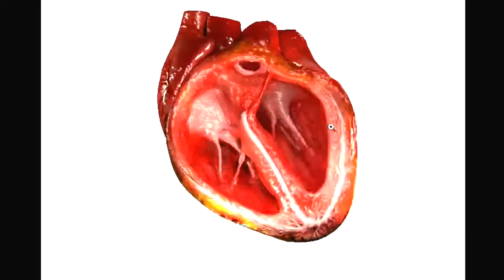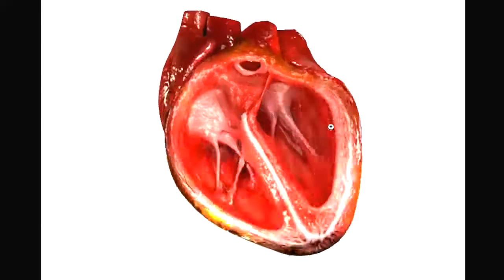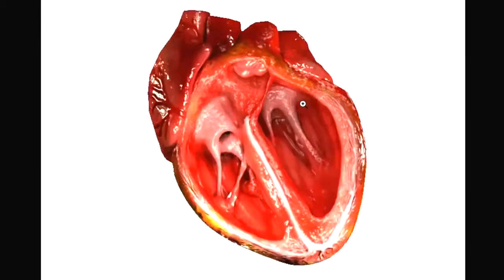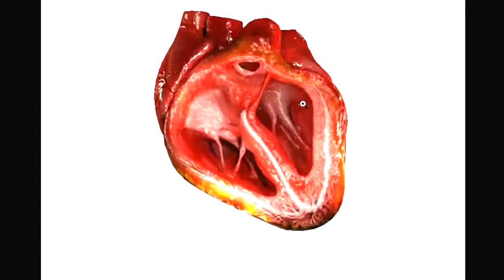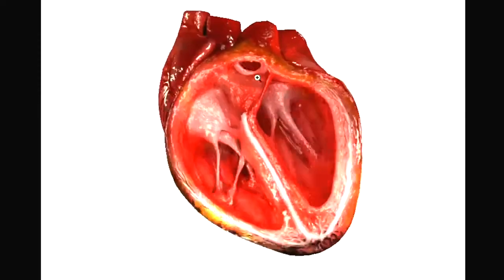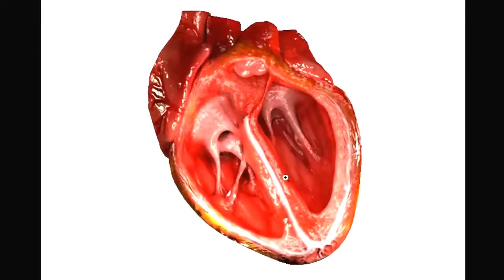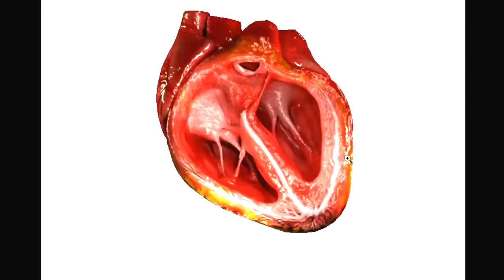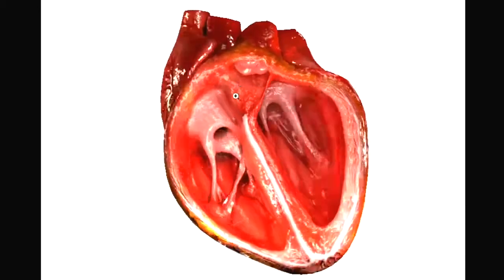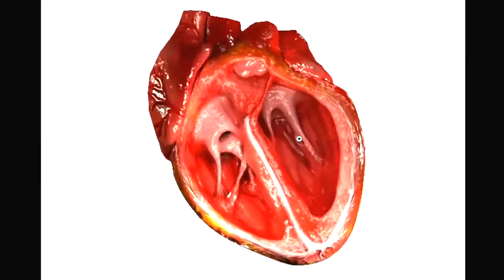In other words, if I had an ultrasound machine, I could see if there is fluid or fluid moving on the ultrasound. What an EKG does is it does exactly the same thing, except instead of fluid moving and objects that you could see, you're seeing electricity moving. And so that is what we're going to look at today. Atria contract first, then ventricles contract second, but they're contracting in concert. And then what happens is everything resets back to normal and you have the same contraction happening again.